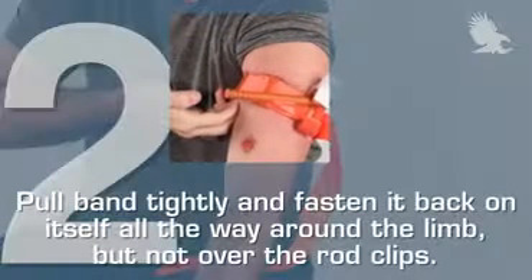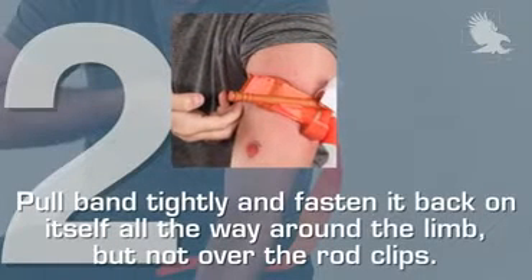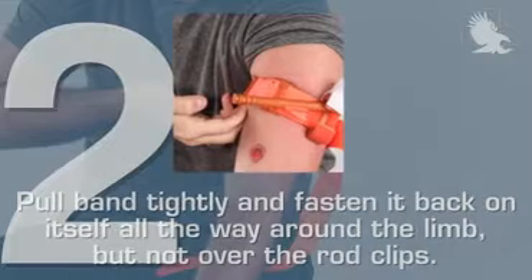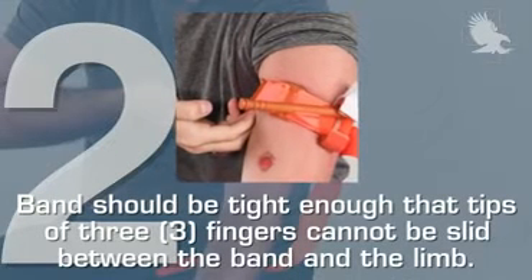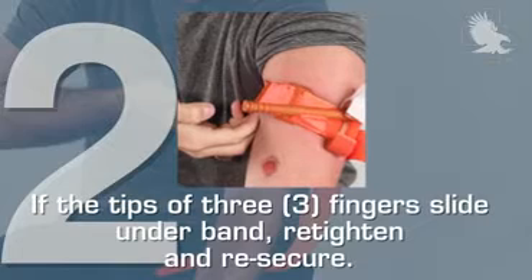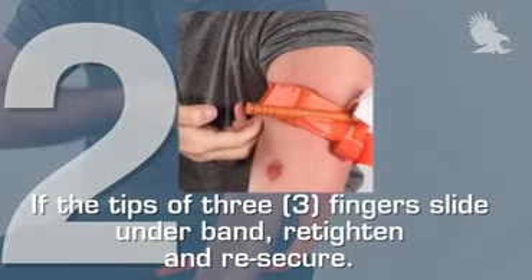Step 2. Pull the band tightly and fasten it back on itself all the way around the limb, but not over the rod clips. Bands should be tight enough that the tips of three fingers cannot be slid between the band and the limb. If the tips of three fingers slide under the band, re-tighten and re-secure.